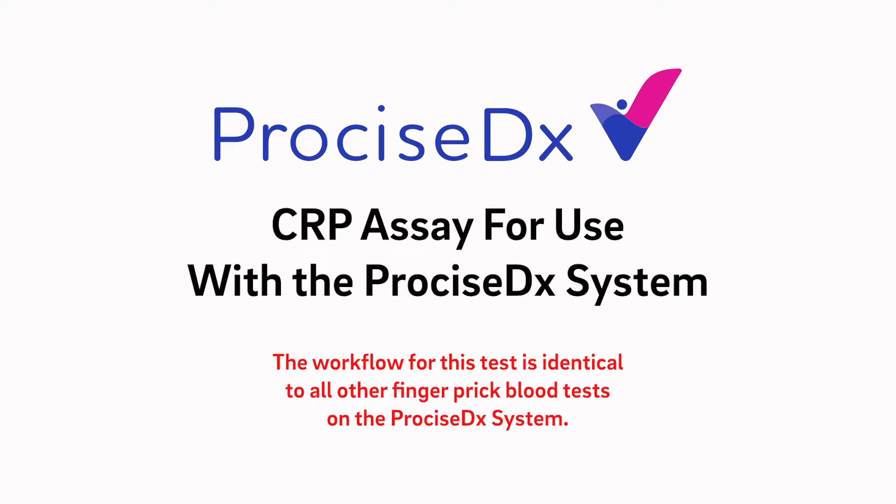This is the Procise CRP assay for use with the ProciseDx system. The workflow for this test is identical to all other finger prick blood tests on the ProciseDx system.